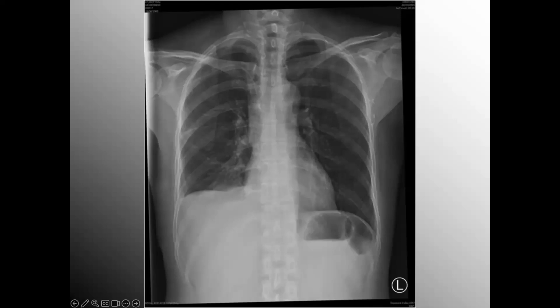These are discrete findings, but if you train yourself to be detail-oriented and meticulous, you won't miss a whole lot. And sometimes I think you can agree on the call that we're one of the first people that have the ability to pull up the chest x-ray. We're at bedside setting up mechanical ventilation, maybe intubation, and they're shooting the x-ray right after some kind of intervention. So you may be first on the scene to arrive and figure out what's really going on.